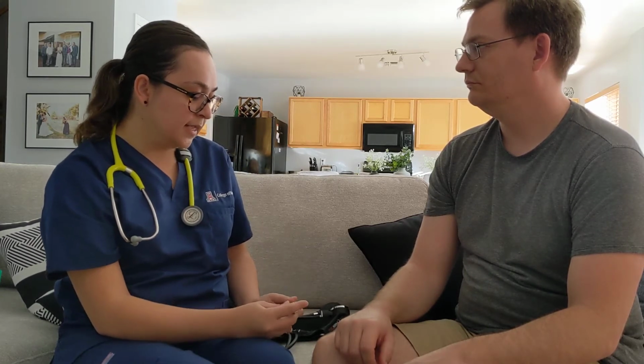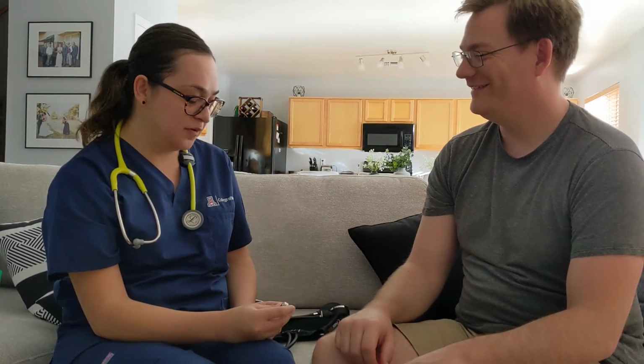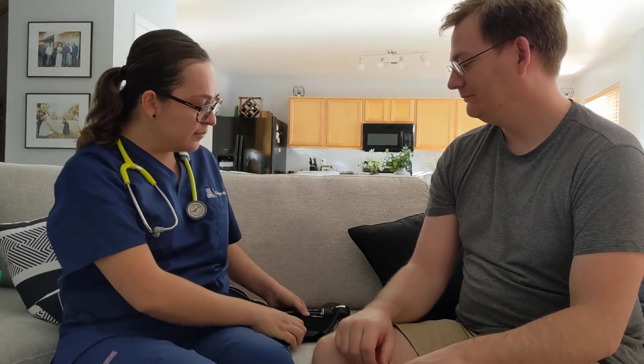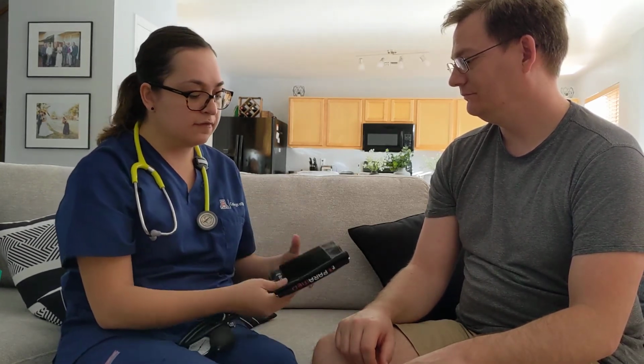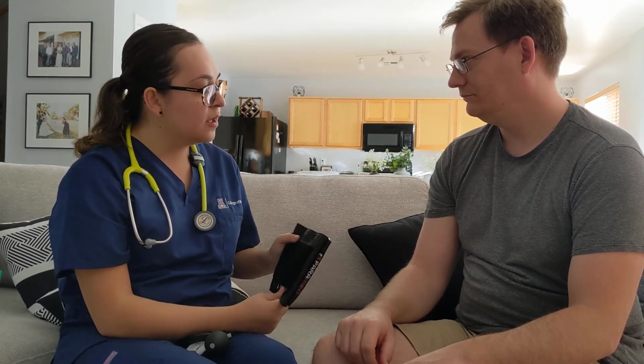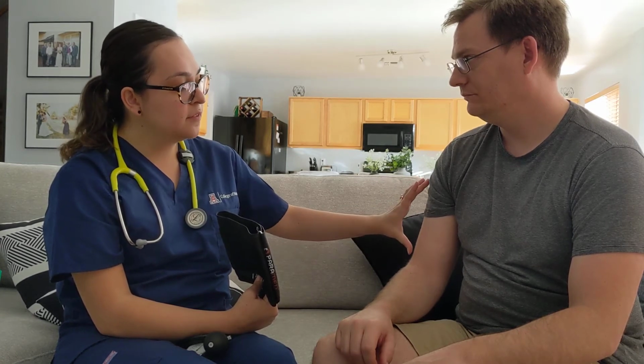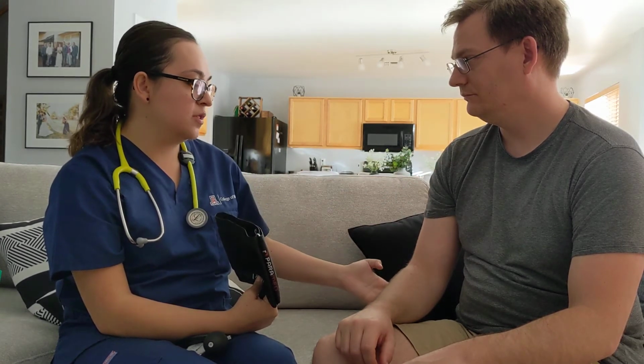So now I'm going to take his blood pressure, if that's okay with you? Of course. Perfect. Okay, so for the blood pressure, I want to talk about correct cuff placement first. So the cuff needs to be about 1 inch above the brachial artery. It needs to cover 2/3 of the arm from the shoulder to the elbow. It can't be too tight, so I have to make sure 1 finger fits inside.